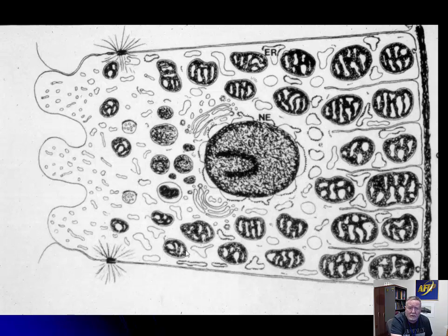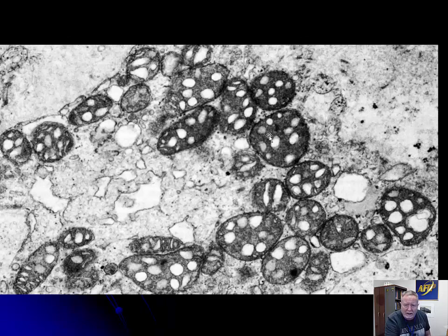And I think that we've covered all the changes. That the desmosomes are still intact, the cells attached to the basement membrane. You may start to see an accumulation of secondary lysosomes, increase in multivesicular bodies as some of the membrane is starting to show wear and tear. And when we look at this, at least we look at the mitochondria and the cytosol on transmission EM. Here's that low amplitude swelling. Okay, yes, it's characterized by a condensation of the matrix, a swelling of the cristae.